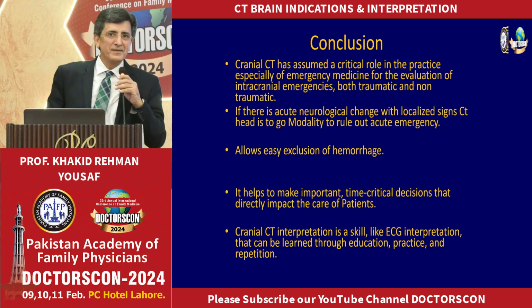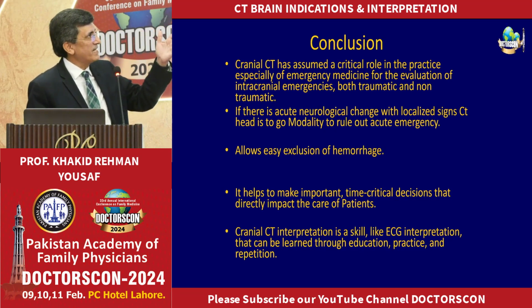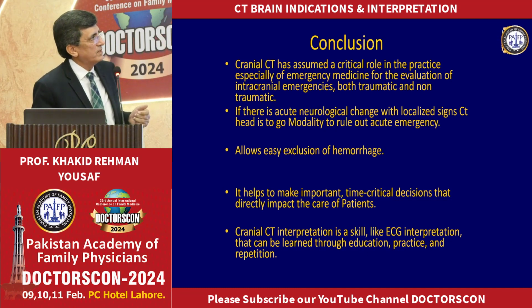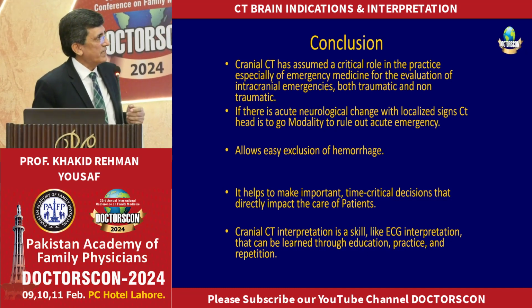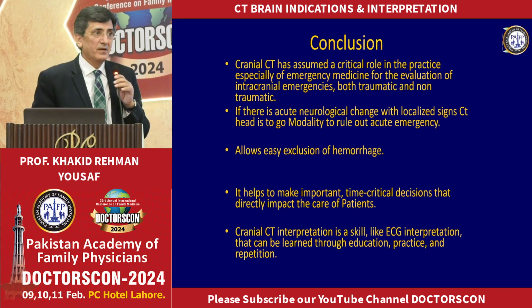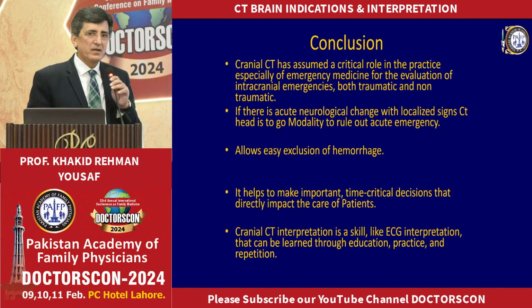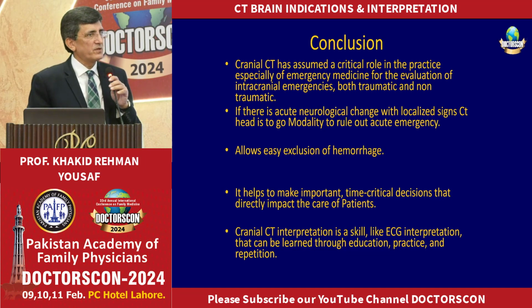My job is done. And this is how cranial CT has assumed a critical role in practice. It allows, in the acute setting, exclusion of hemorrhage. That is the most important thing. When the patient is suspected of a stroke, we have to rule out whether it's an ischemic stroke or a hemorrhage. For ischemic, we have to thrombolize.